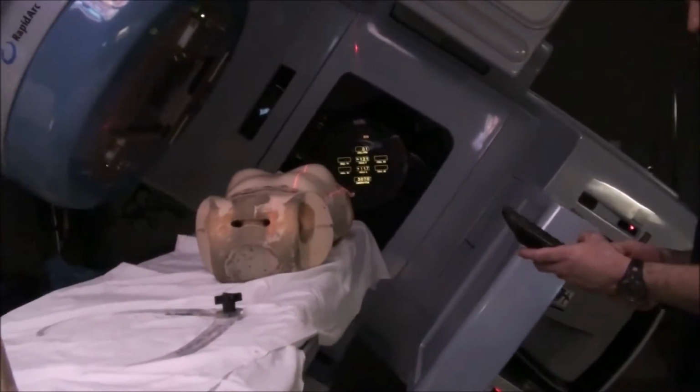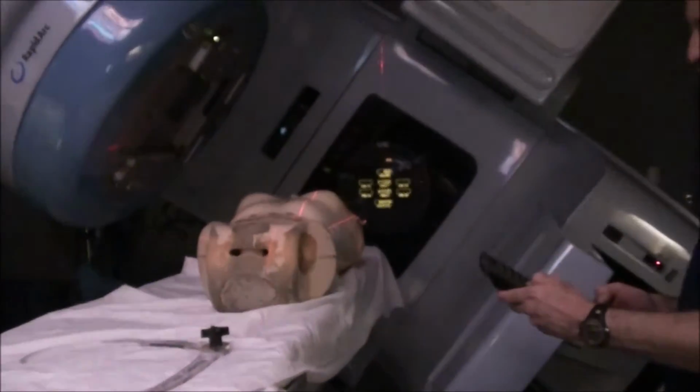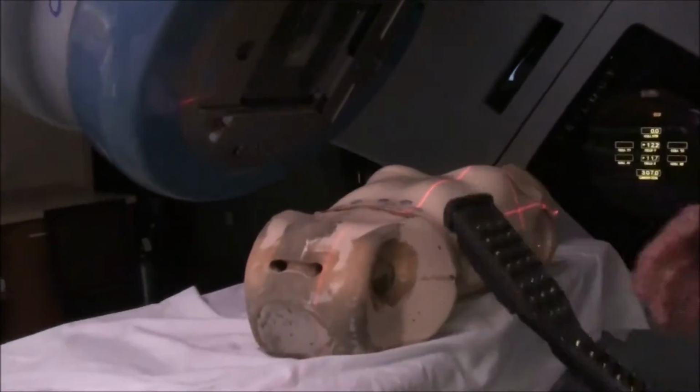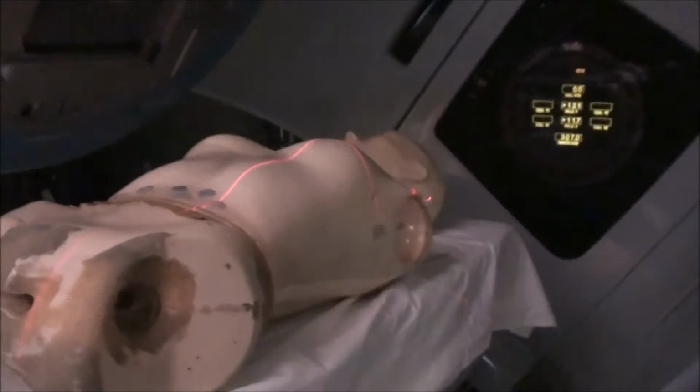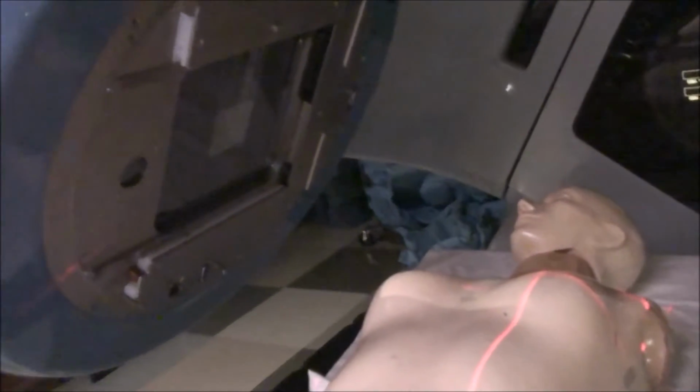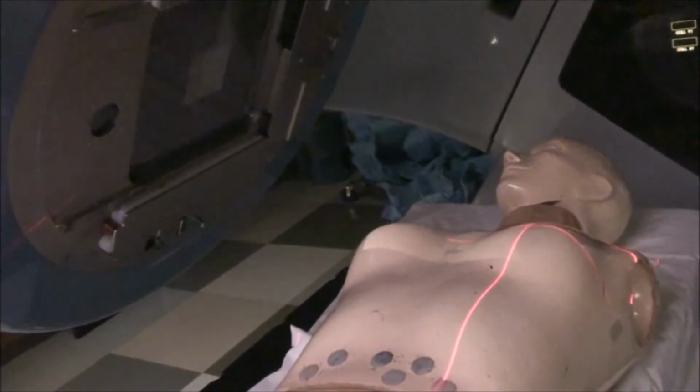So I'm going to go ahead and turn that field size on. You can see when I rotate it around, I don't have a field size set or anything. I want my entry point to be such that it's right about at the mid-sternum.